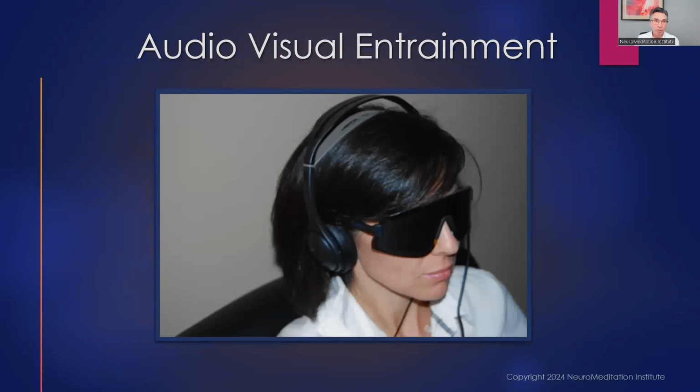So, you guys know what it looks like, but that's kind of the basic setup. Just these sort of 1980s science fiction looking glasses and some headphones.